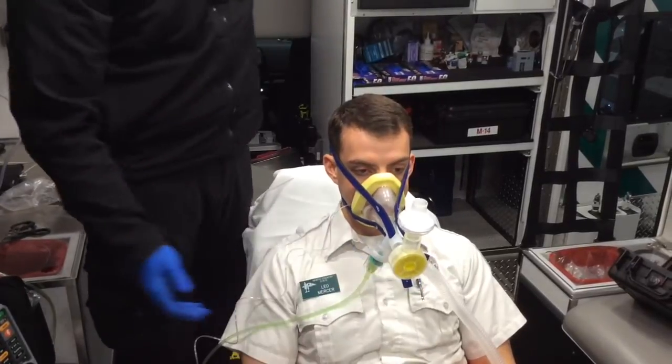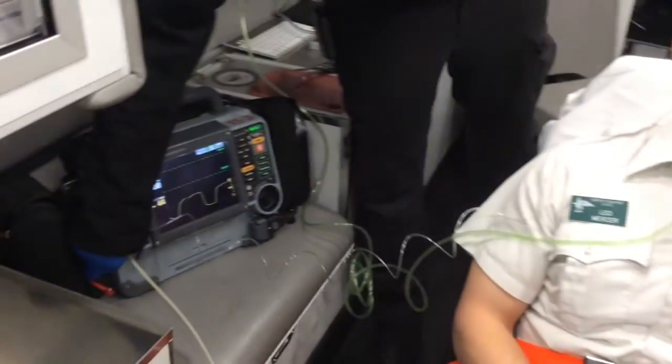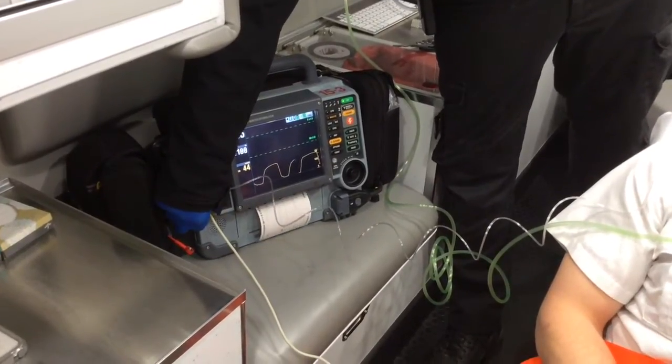If the mask is too heavy, have your partner hold it. To finish, it is always a good idea to push print. This is likely a critical patient and their vitals should be taken every five minutes.